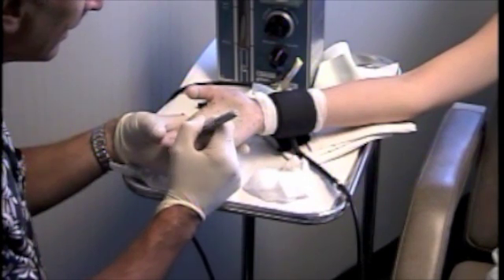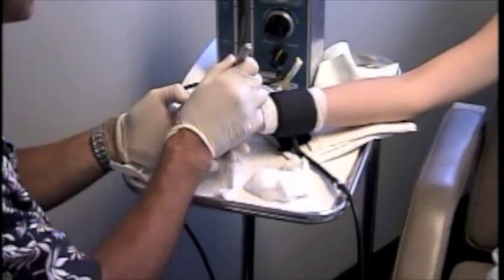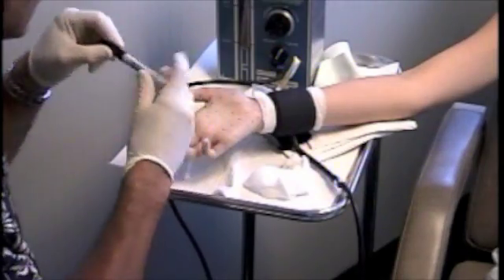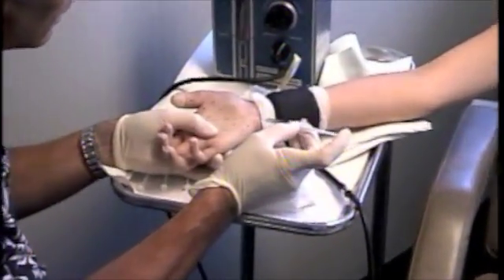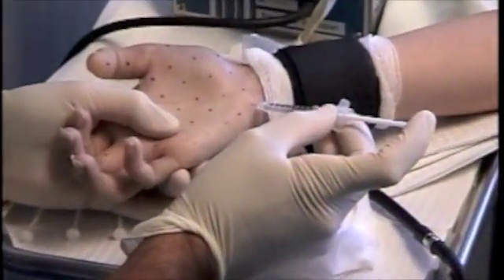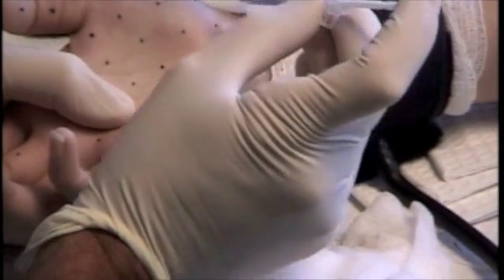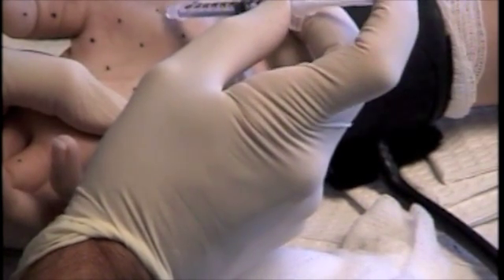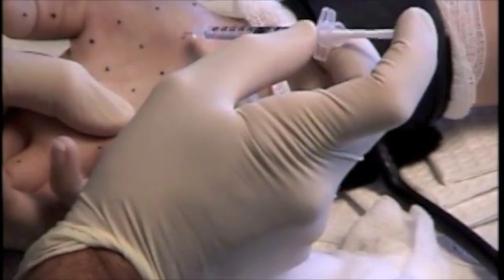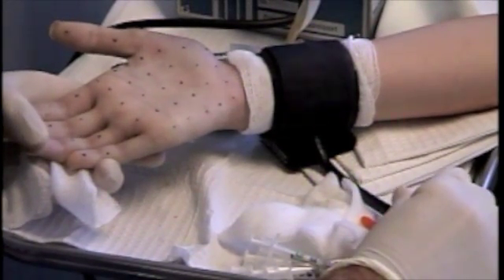One area you'd like to avoid, or inject as small an amount as possible, is the thenar eminence — the muscle group at the base of the thumb which causes the thumb to go over the palm. Even though you inject into the skin, into the dermis, what can sometimes happen is the Botox moves into the muscle and can cause some thumb weakness, such as when pushing a button through a buttonhole. This lasts approximately two to three weeks if it does happen — much less than the four to six months that the Botox lasts. I'm injecting at a 45-degree angle with the bevel going up. When I let the tourniquet down, the pressure from the blood going back seals the wound and prevents any blood, and more importantly Botox, from leaking out of the skin. As you can see, there's hardly any blood coming back as I let down the tourniquet very slowly.